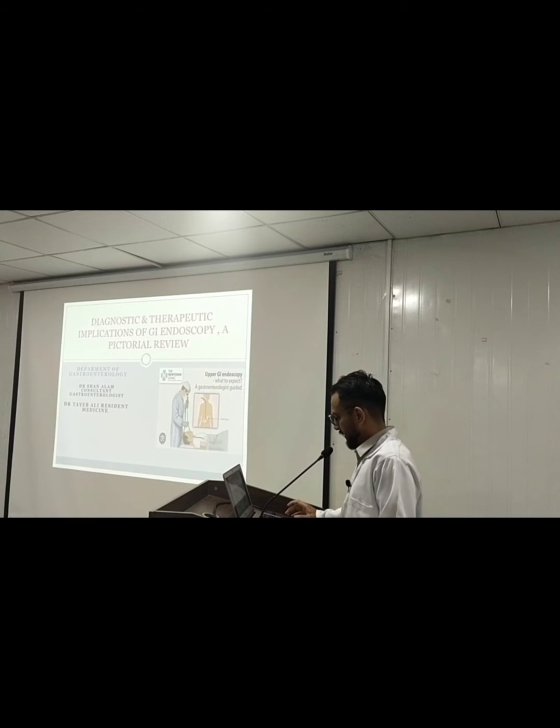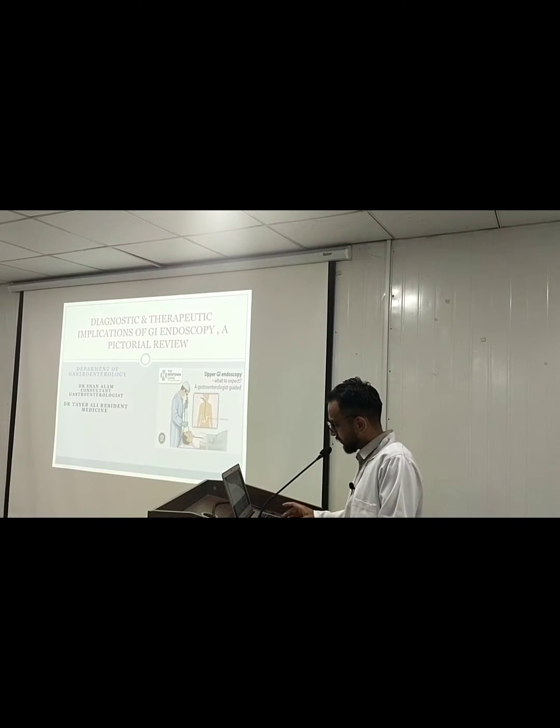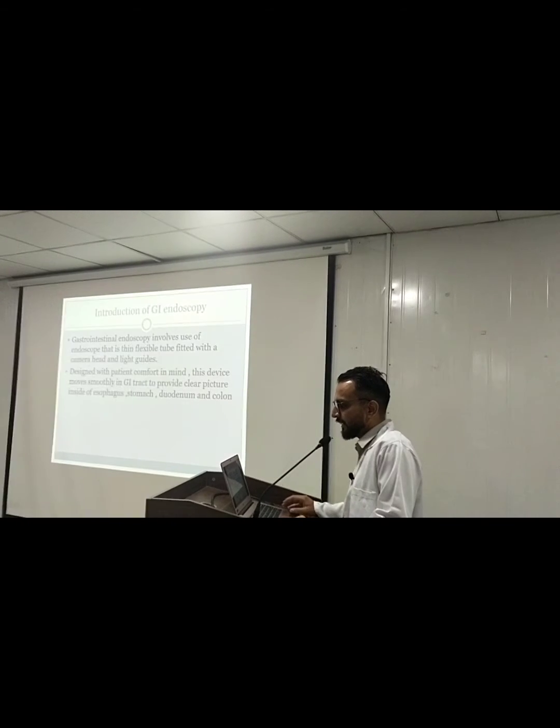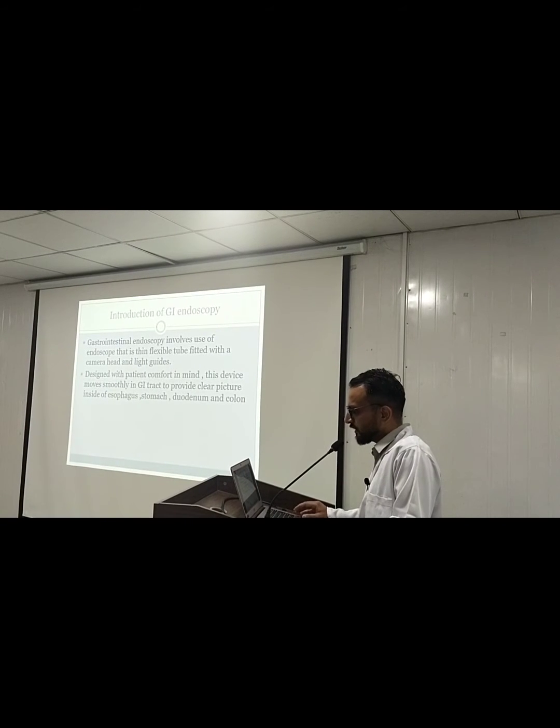Good morning. I am Dr. Tayyab, resident medicine, and today I am going to present the diagnostic and therapeutic implication of GI endoscopy. First of all, I will give a short introduction about endoscopy. So, what is endoscopy? Gastrointestinal endoscopy involves use of an endoscope, that is a thin flexible tube fitted with a camera head and light guides. The gastrointestinal endoscope is designed with patient comfort in mind, so that this device moves smoothly in the GI tract to provide a clear picture inside of the esophagus, stomach, duodenum and colon.